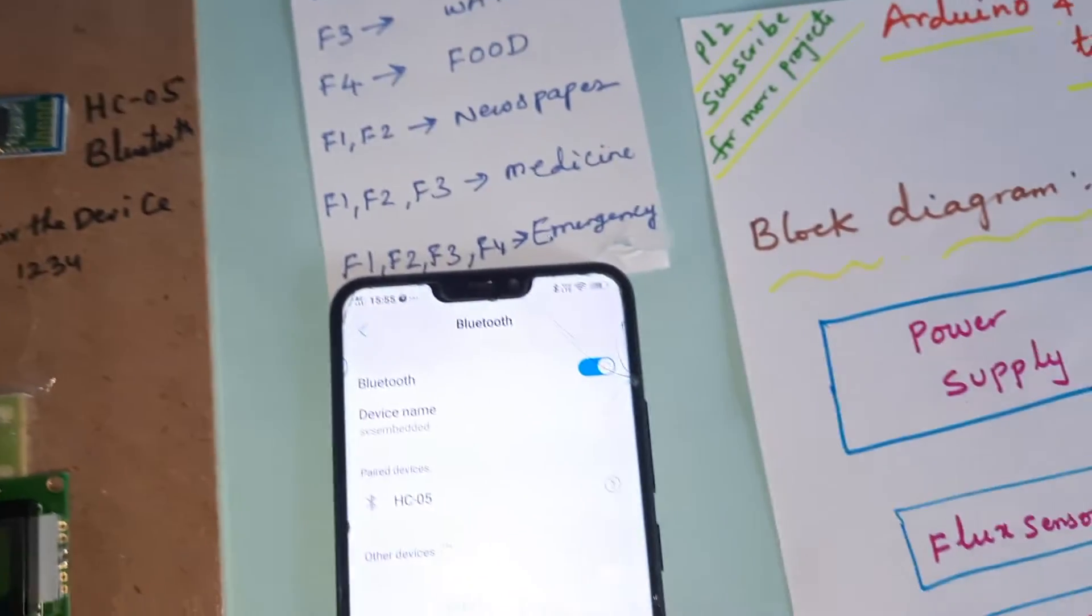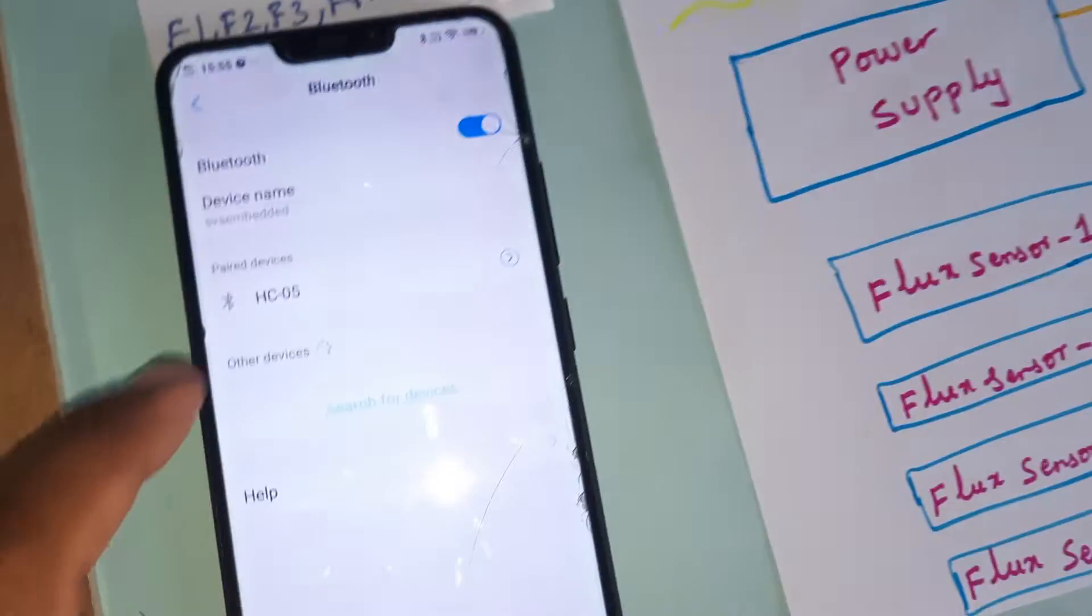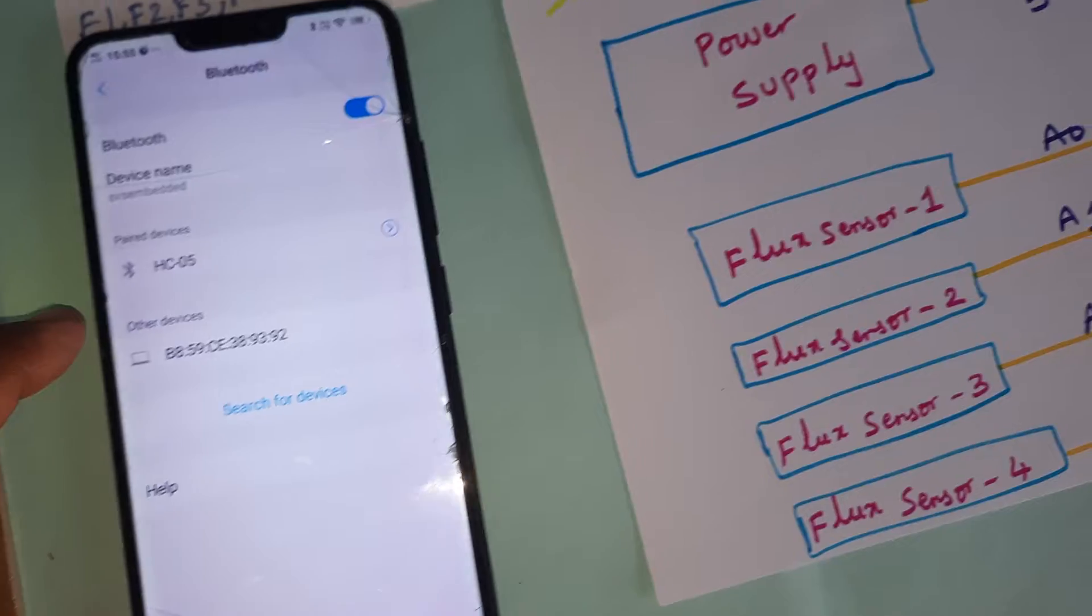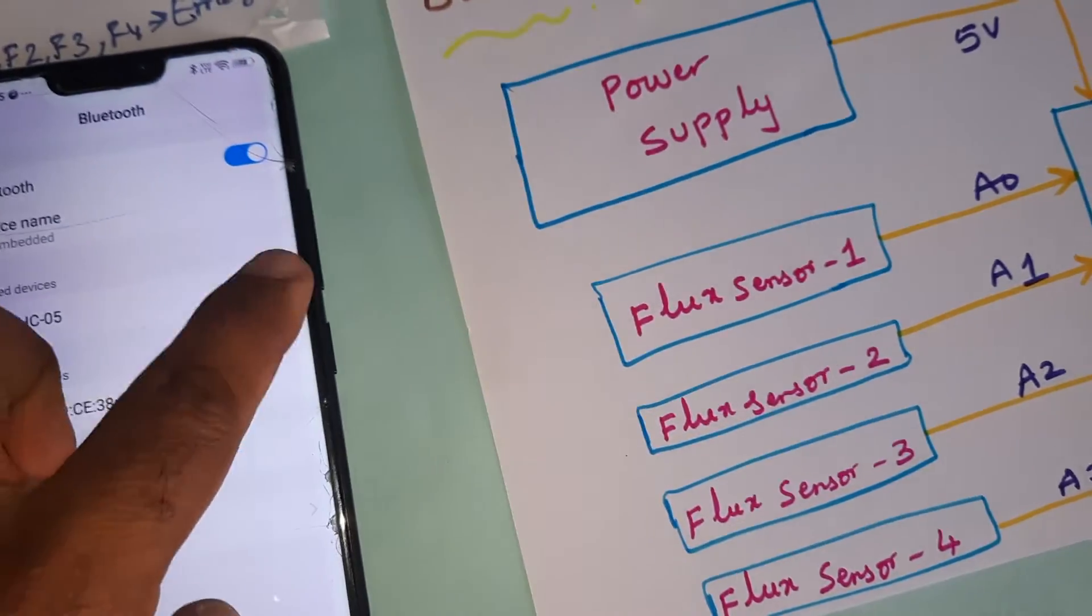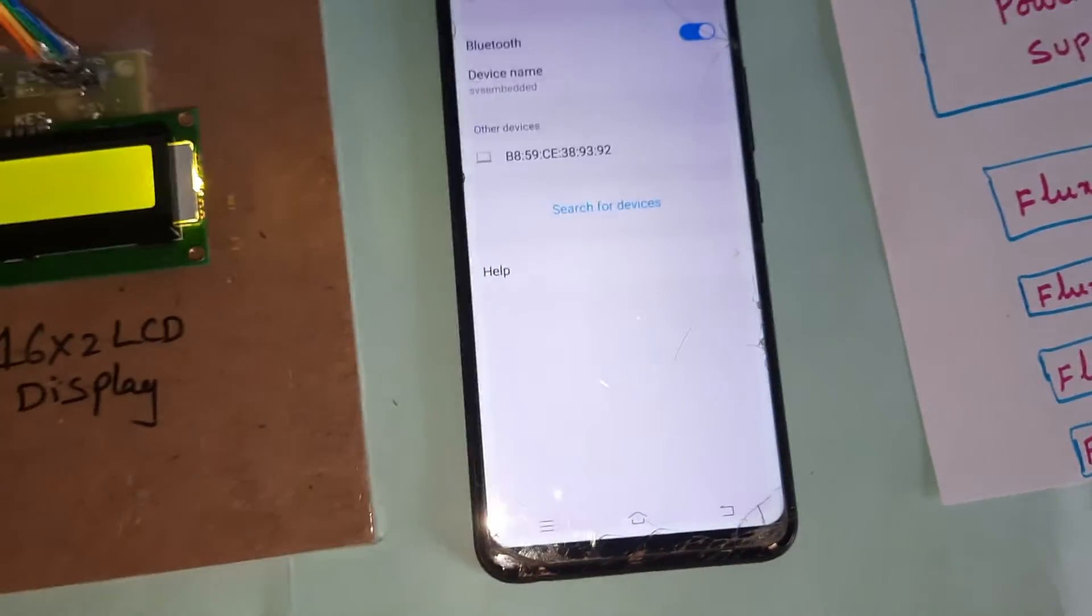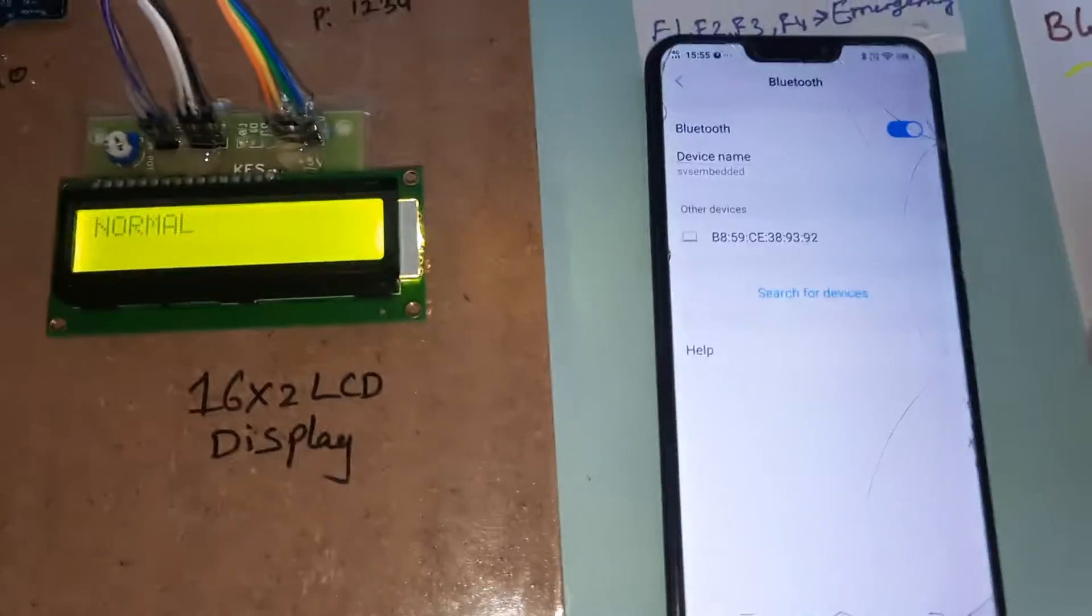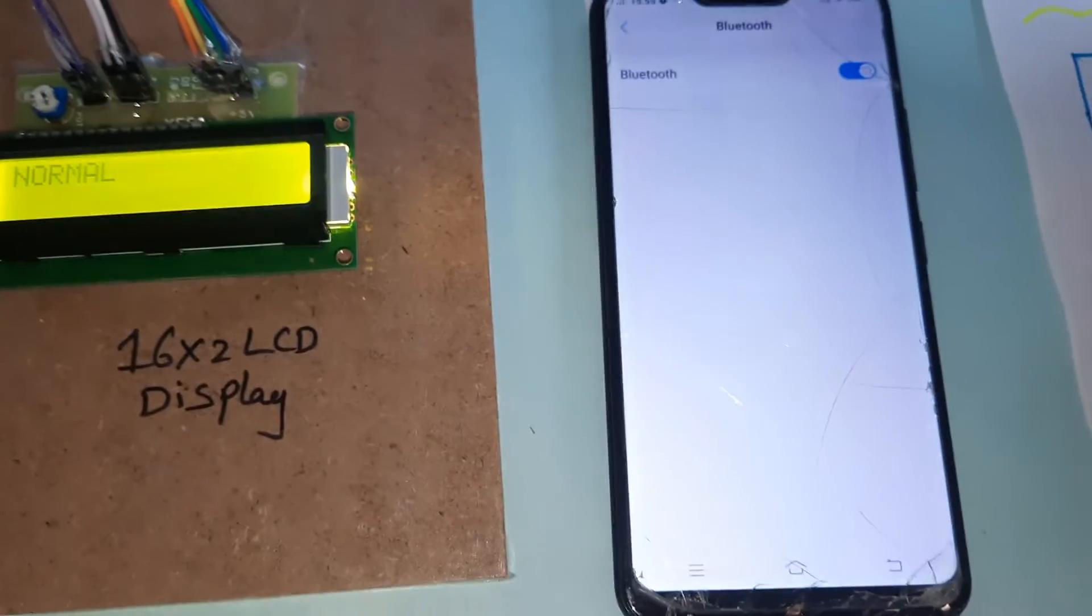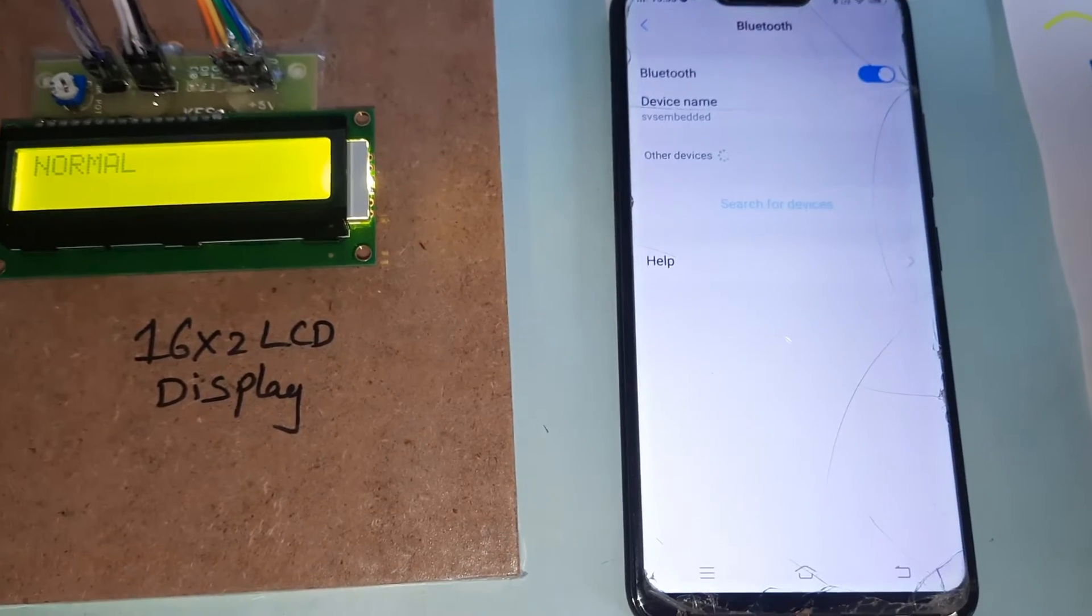We are using one HC-05 Bluetooth module. When first it will ask for pairing. It is already paired. If you go for unpaired, it will show the pairing option.